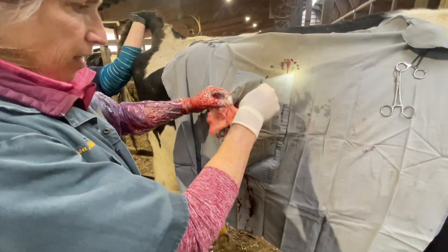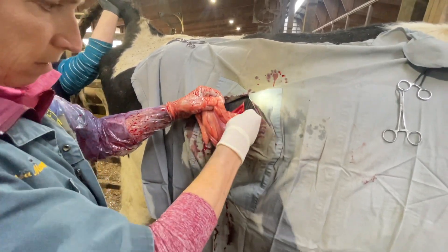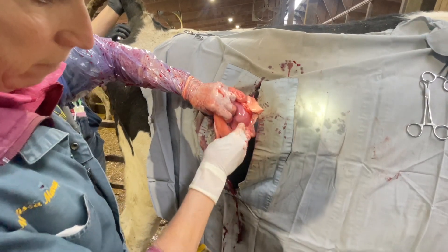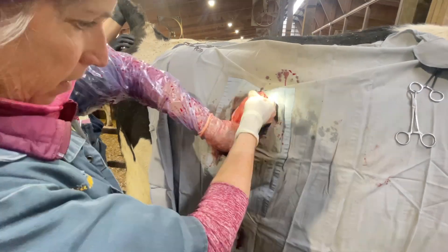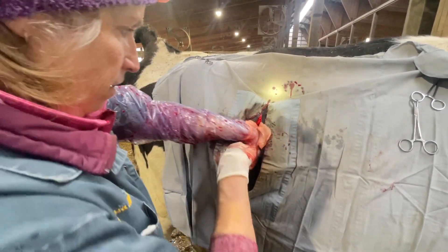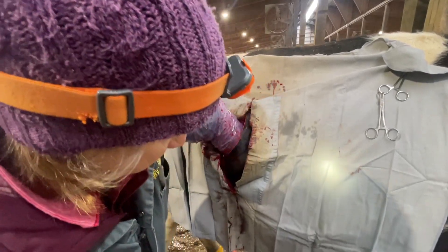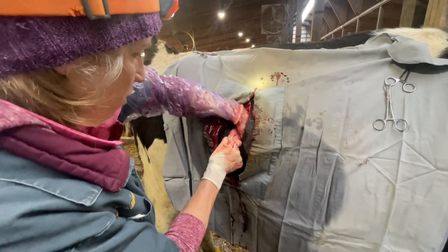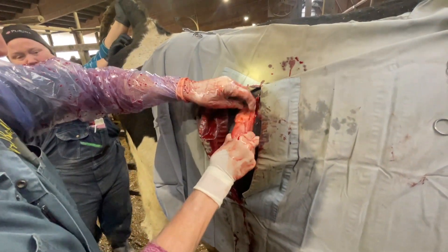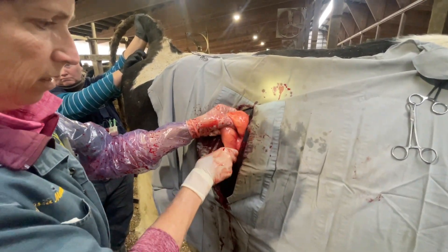Is that the abomasum in your hand? This is called omentum — it's all fat, fat storage for when she might need it later. That is a piece of gut called the duodenum. The exit to the abomasum — the pylorus — is close to that. I'm going to go a little bit below that. So that's the exit to the abomasum called the pylorus — it's really thick and muscular. And that's what you want to stick right into the incision here, so that she doesn't try and displace her abomasum again.